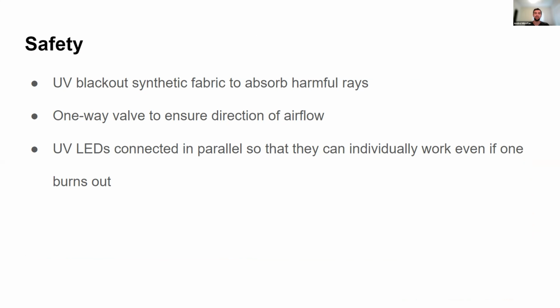And from an electrical perspective, we also wanted to make sure that failure of one of the LEDs inside doesn't cause failure of the entire device. So we coupled all the components in parallel and connected them to a 9-volt battery to ensure that this device is portable and is also able to function even if some components might fail.